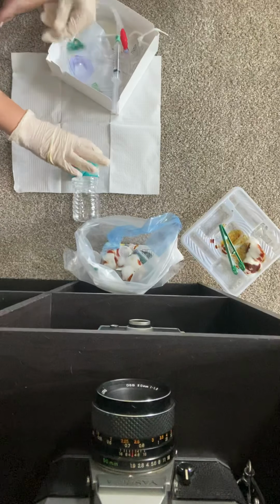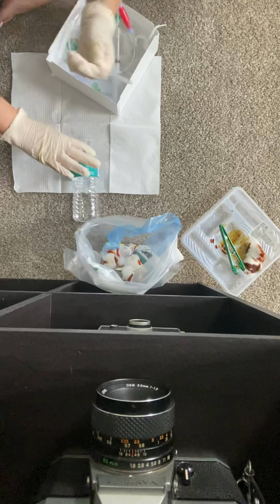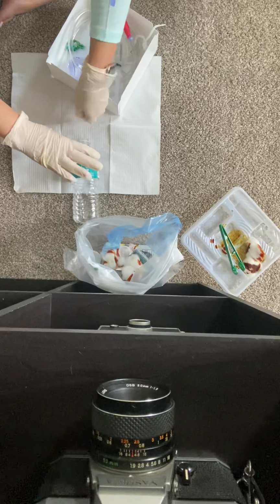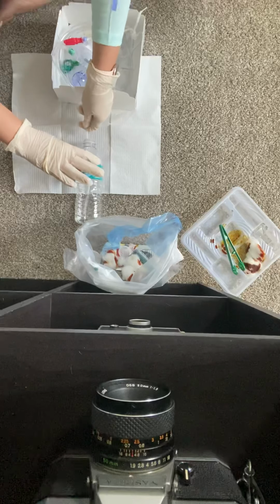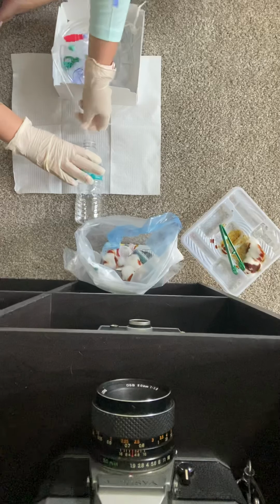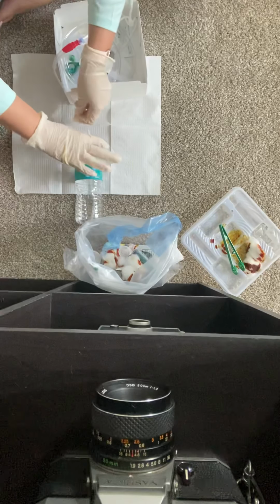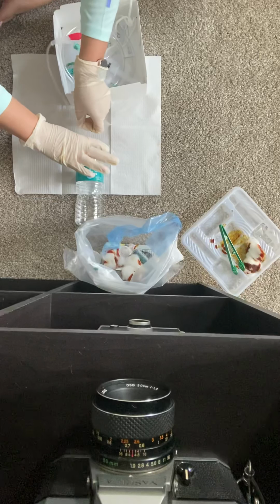I know it just fell out. Okay, so I'm going to keep inserting here. I still have my labia exposed. And as soon as I see a flash of urine, that's when I'm going to advance. Sorry, it keeps falling out. I know in real life it probably wouldn't be falling.